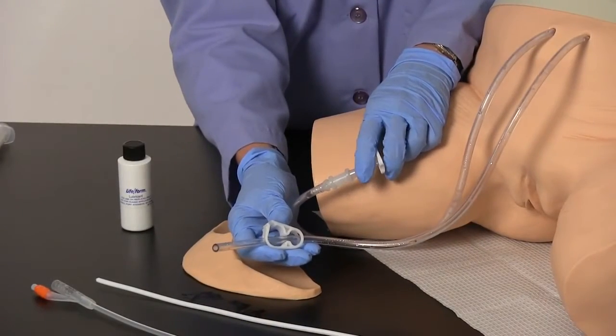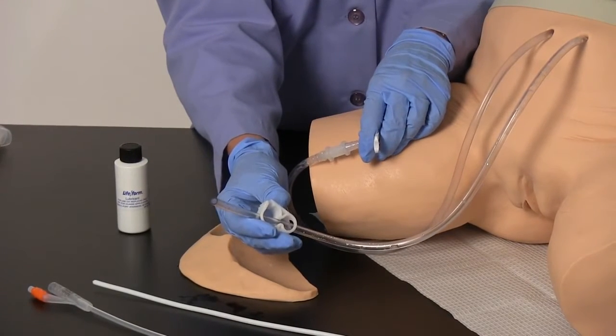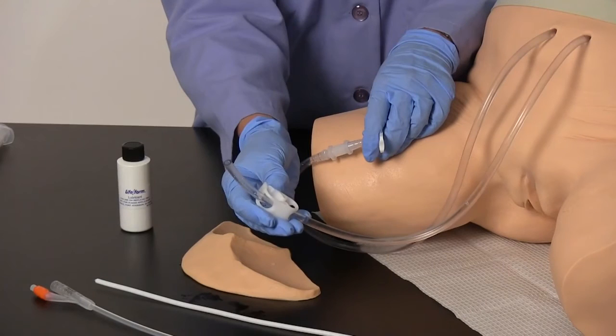To fill the simulated bladder inside, open both the slide clamp and the pinch clamp, allowing water to flow through, charging the system, and then close the pinch clamp on the drain tube. Your simulator is now ready to perform catheterization procedures.